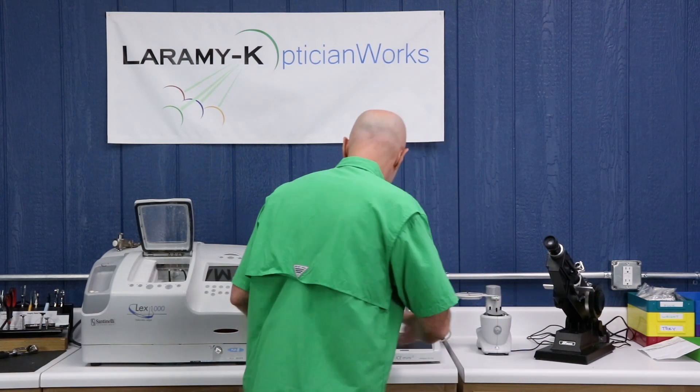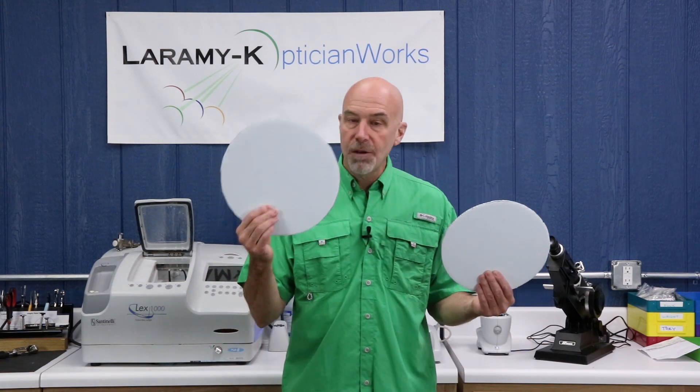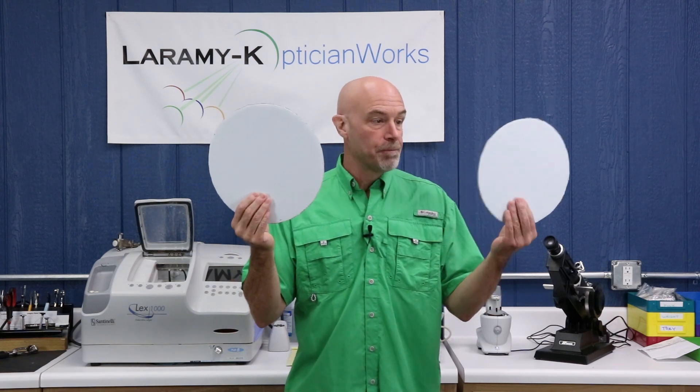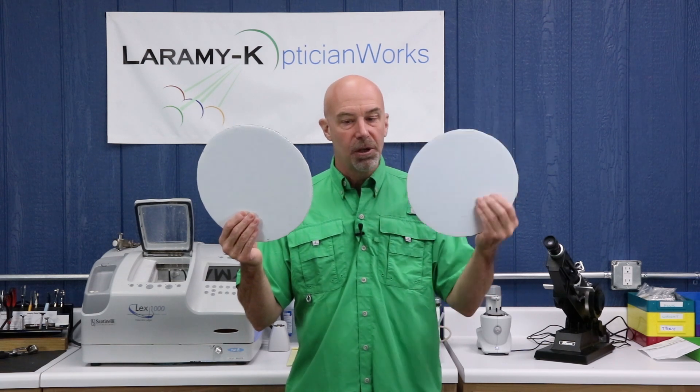What is AR slip? AR slip is when you have a lens and your wheel inside your edger is spinning very, very quickly — a couple thousand RPM or so — and your lens blank is coming in, turning real slow.